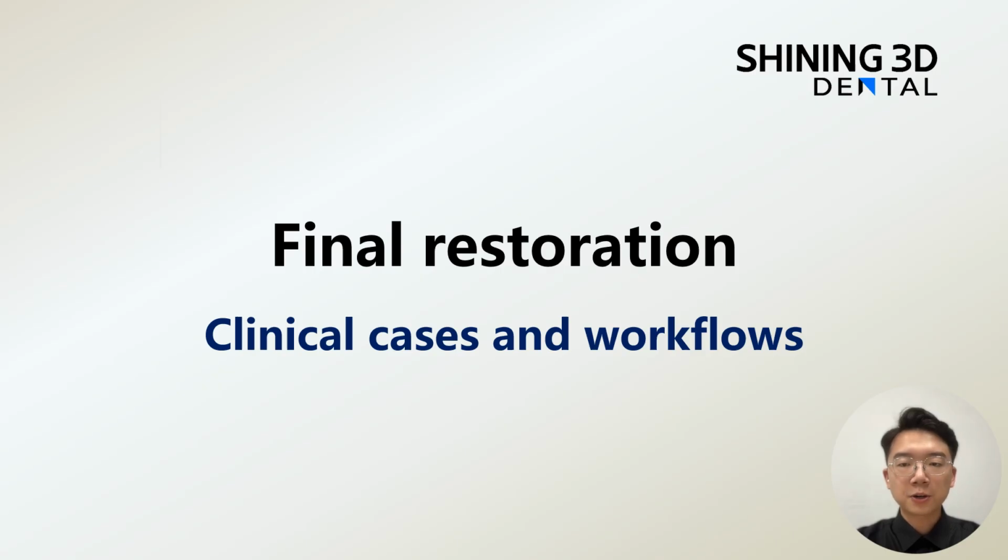This is the final part of today's basic training. In this part, we will give you several clinical cases and workflows related to the full arch fixed implantation. For these two different clinical cases, one is the final restoration and one is immediate loading. We'll give you detailed information of how to create an order for that, what kind of information or things that we need to select. And we will also give you detailed information of how the whole workflow is going to be and what is something that we need to pay attention to during the whole scanning process.